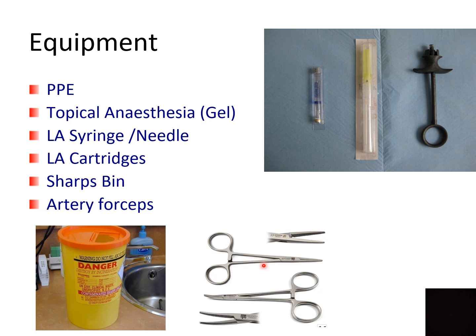Before it disappears in the soft tissues, you are able to grab the broken end of the needle with a hemostat. So that's quite a useful instrument just in case you break your needle. It isn't normally available, but for safe practice, you should always have one by your side just in case the needle breaks.